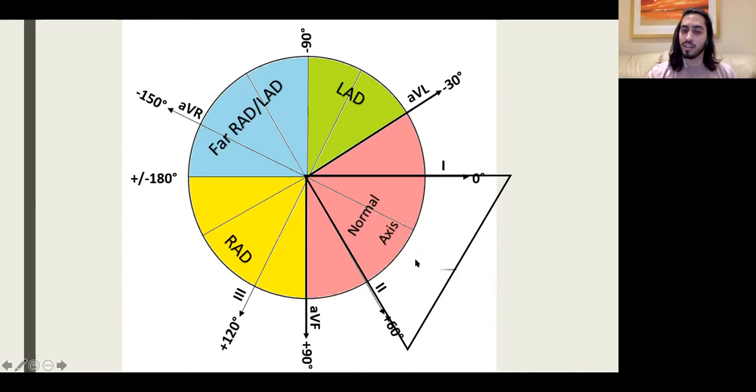But the only difference here is that they've just translated lead 3 over here just to make the circle look a bit nicer. But otherwise, that's exactly what we've talked about in terms of the viewpoints of the heart, if that makes sense.